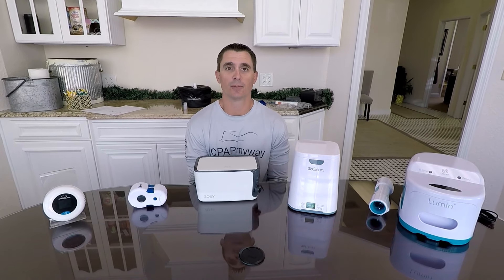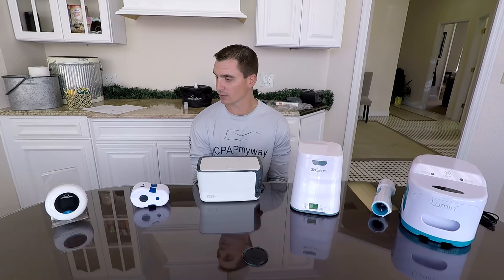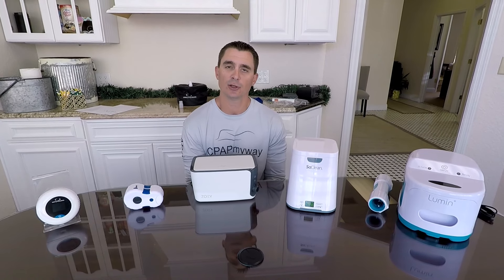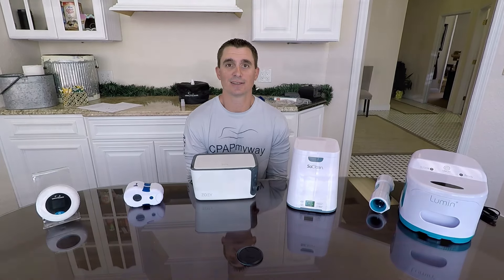We are constantly asked what's the best CPAP cleaner for me or my CPAP machine, so we're going to give you some great pointers on each CPAP cleaner, how they work, and then you can determine what's going to be best for your particular scenario and your particular budget. So let's take a look.